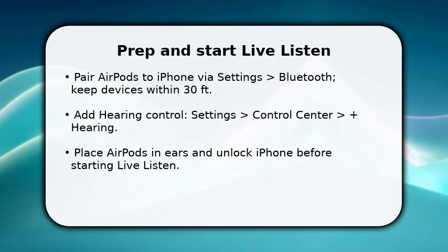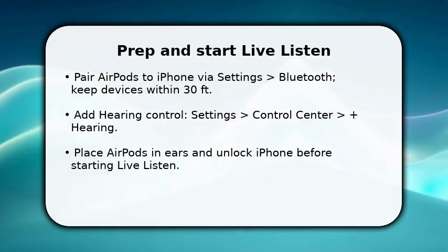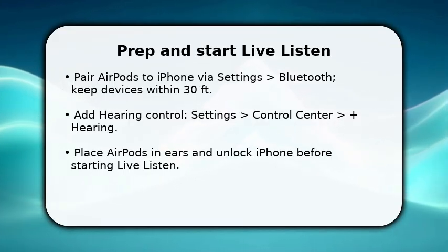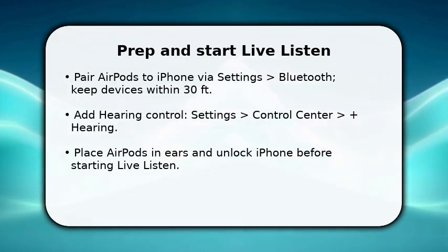This starts the Live Listen toggle flow. Do this now so the iPhone can use its mic to send sound to the AirPods. It's the core connection that enables real-time amplification.